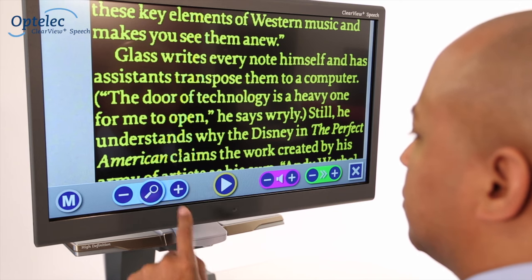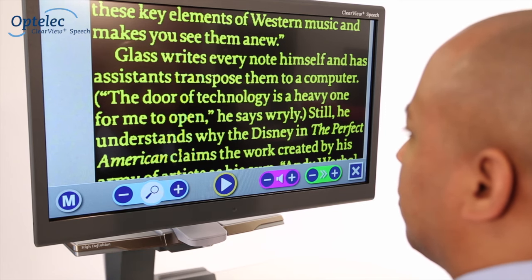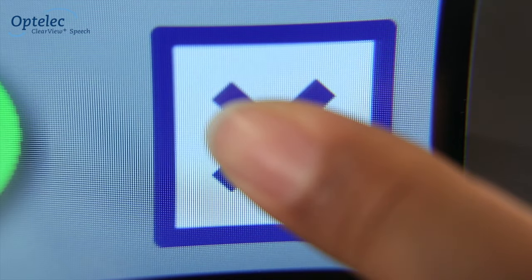By selecting the magnifier glass, you'll see a full-page overview of the whole document. Do you want to listen to another document?